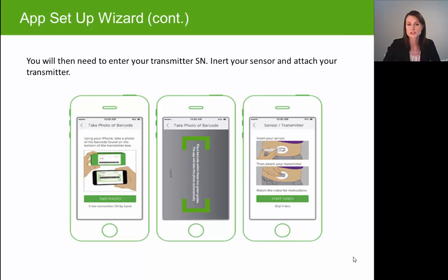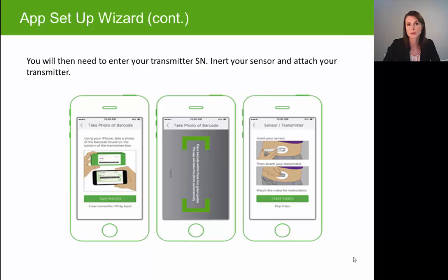If you select 'Enter transmitter serial number by hand,' you can manually type in your transmitter ID. If you select 'Take photo,' it will bring the camera up on your phone with green markers, and you'll want to take a photo of the longest barcode on the white sticker on your transmitter box. Line those green markers up with that barcode — you might want to turn your phone horizontally to fit the barcode within the markers — and it will take the photo and enter your transmitter ID.